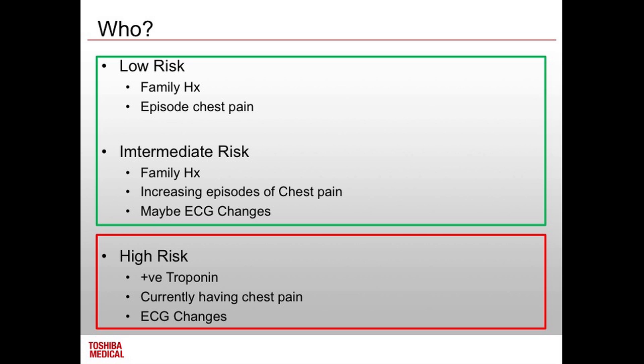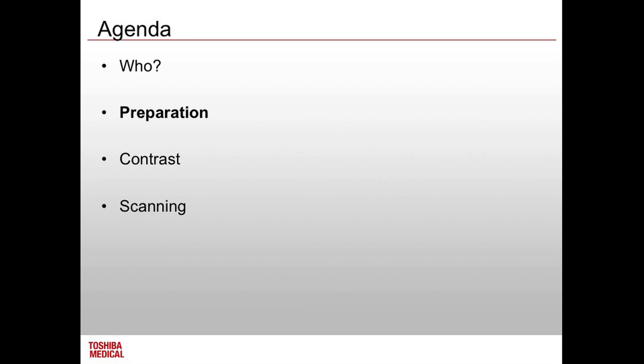So preparation. You cannot put enough emphasis on prep for cardiac. When I was an application specialist, you'd always get a call about 6 months later and they'd say, our cardiacs have gone off, we need you to come back, there's something wrong with the machine. So we go back, and you find they weren't cleaning the skin properly, they weren't attaching ECG leads, they weren't getting good traces, or they weren't prepping them properly with beta blockers. So prep is where it's at. If you get your prep right, then CTCA becomes a breeze, particularly with your machine.